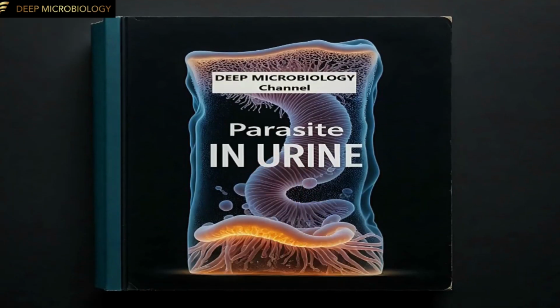Today, we present the final episode in our urinary microscopy series, Parasites in Urine. Let's dive in.